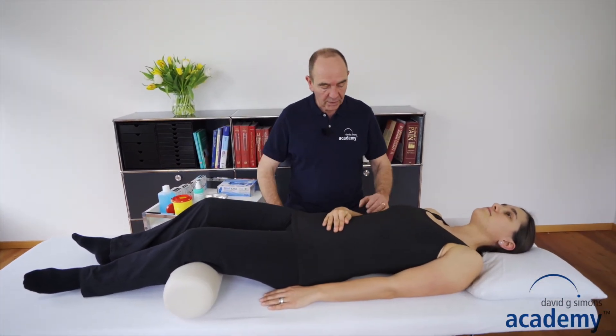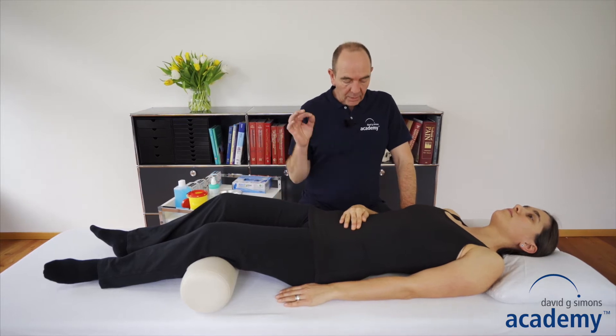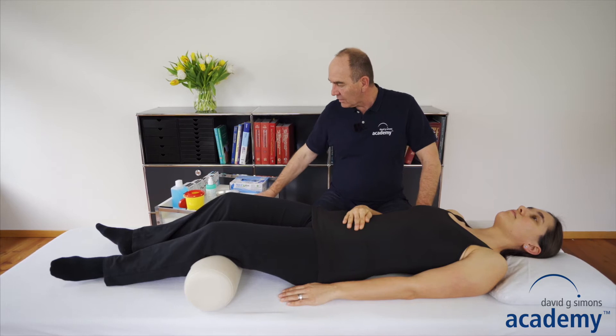Let's get into a relaxed position. The muscle must be relaxed and you can either sit or stand, but be sure that you are comfortable. I will needle with my right hand, so the trolley should be on the right side.